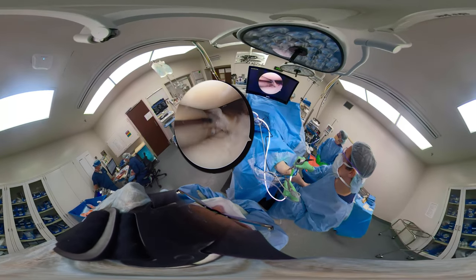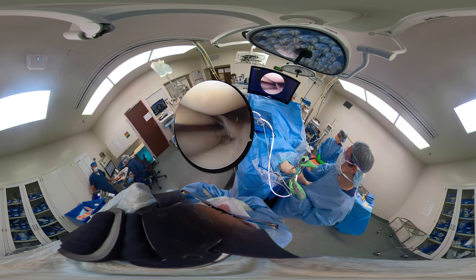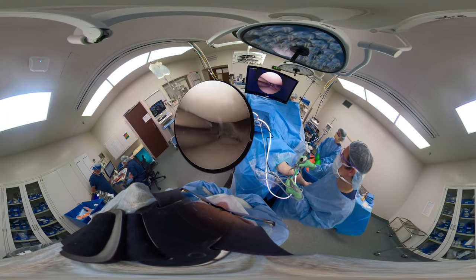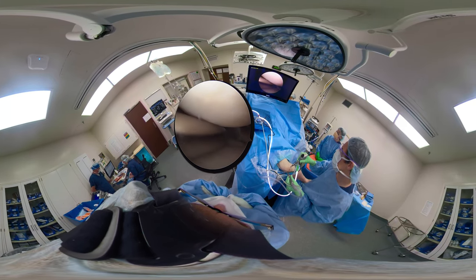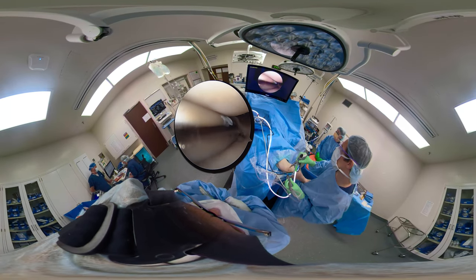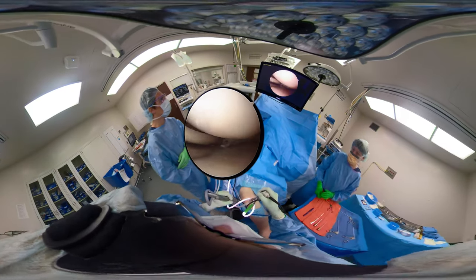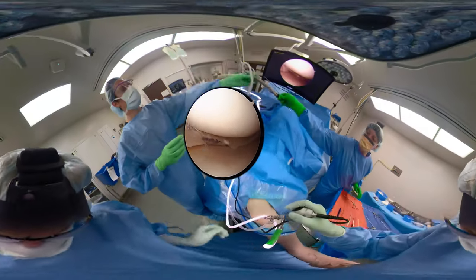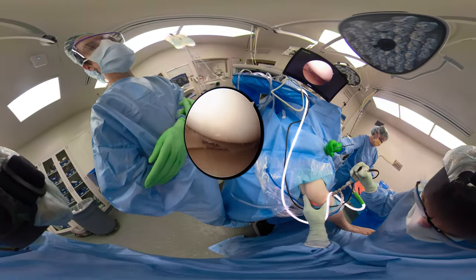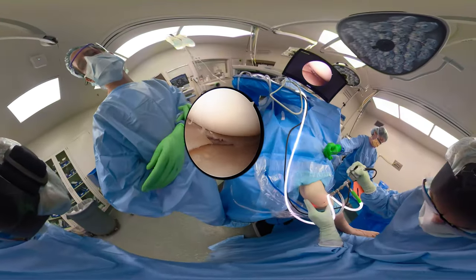After performing arthroscopic partial medial meniscectomy, we'll probe it over the root attachment. Tibial eminence is right in front of us. A little undulation or flounce to that medial meniscus. I have taken the scope now — the resident is observing while using the motorized shaver. We try to keep the instruments on the mayo close enough so we can put them up. Don't want to drop anything on the floor.